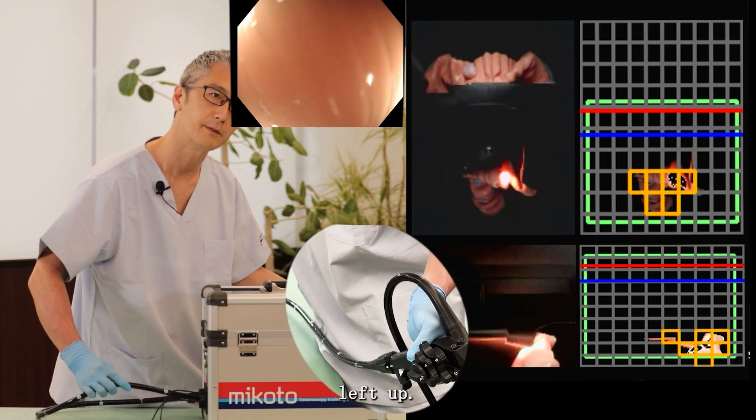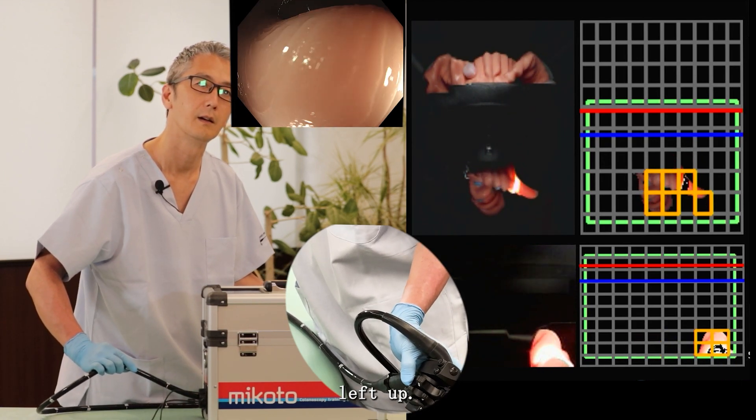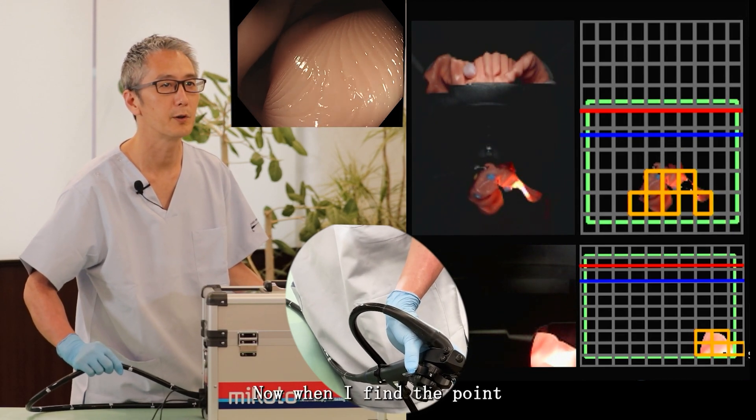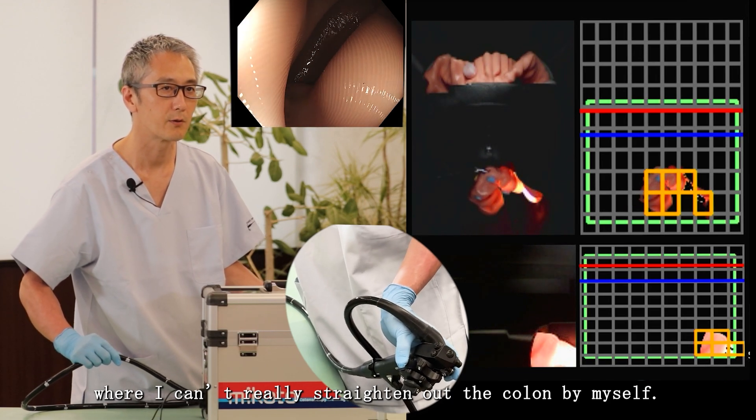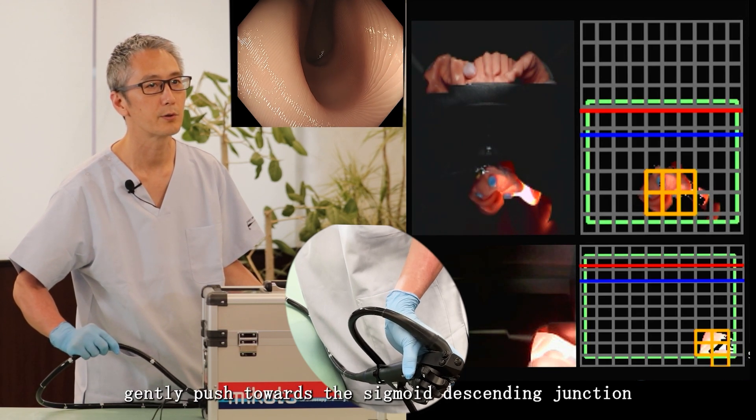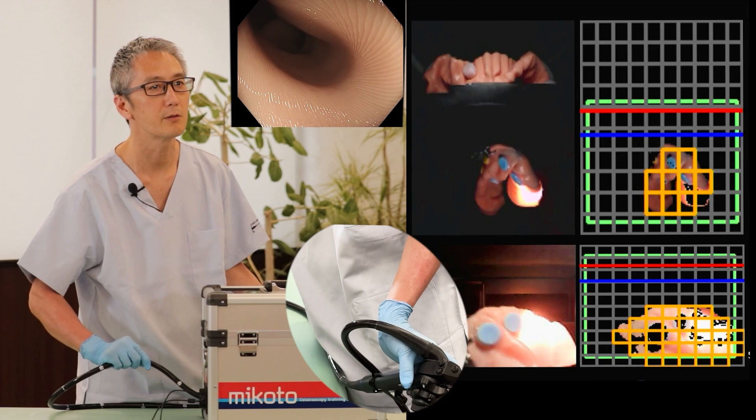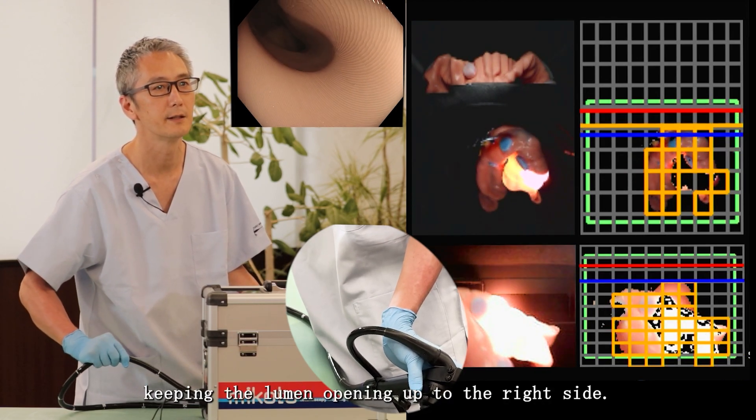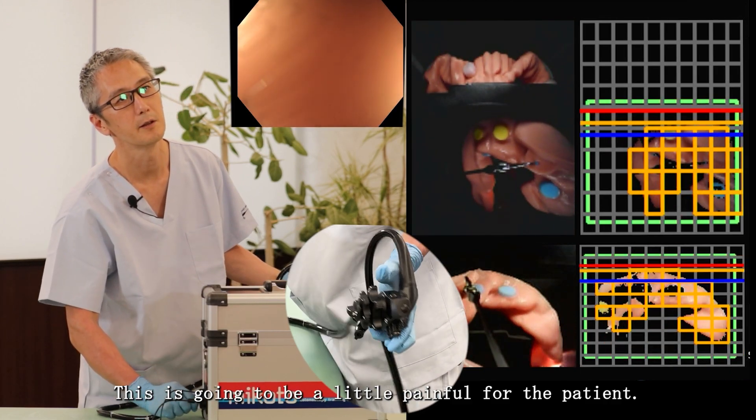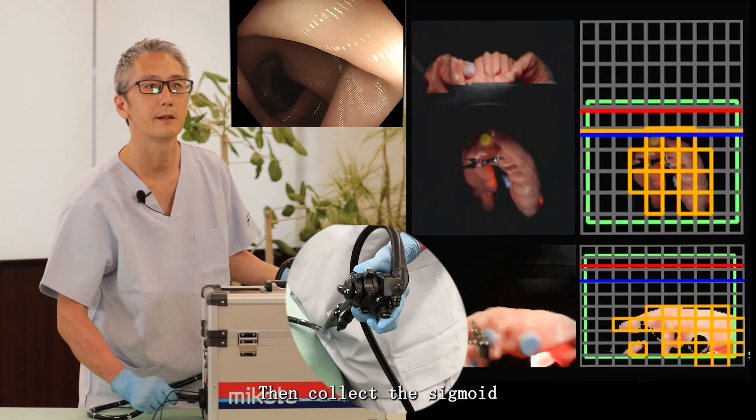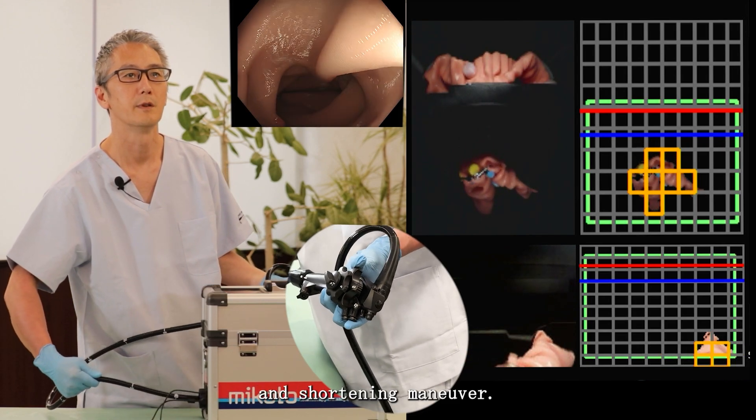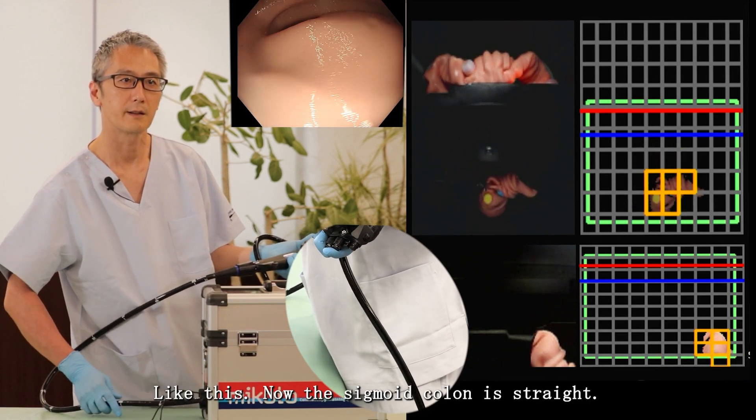Left up. Now I find a point where I can't really straighten out the colon by myself, and I'm going to try to gently push towards the sigmoid descending junction when the lumen is open up to the right side. This is going to be a little painful for the patient. Then collect the colonoscope with the right torquing and shortening maneuver like this.